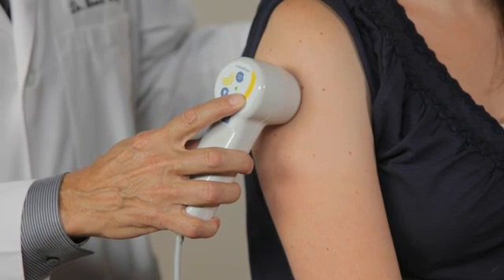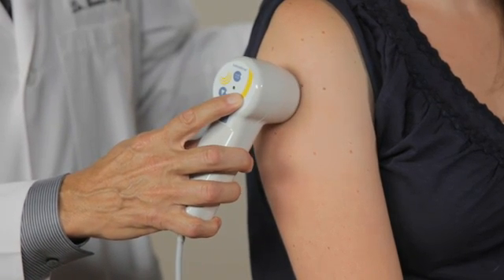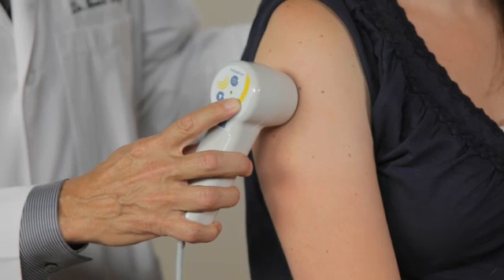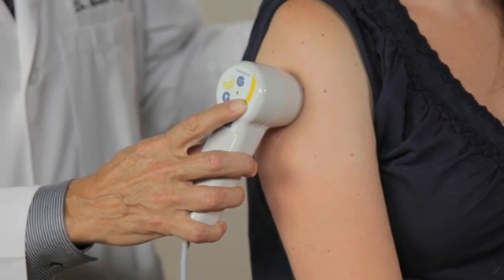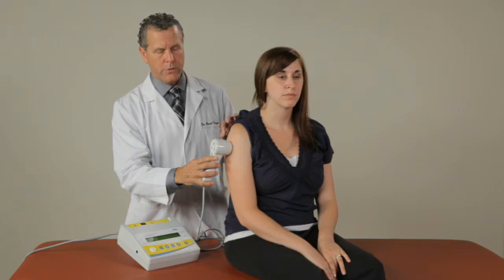What we'll do is slowly increase the arrow up for the e-stem. As you see, the light is turning green and as we move up, the patient may or may not feel it. It's sensory or subsensory, meaning the patient, depending on the individual, will feel it.